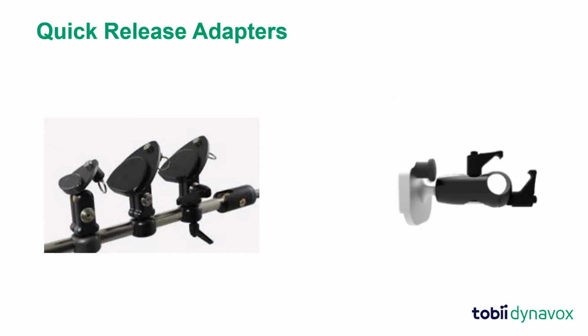The quick release adapter attaches to the horizontal tube. The task of the quick release adapter is to connect the AAC device to the mounting system. It is called the quick release adapter as it allows the user or caregiver to quickly attach the AAC device to the mounting system or to remove it.